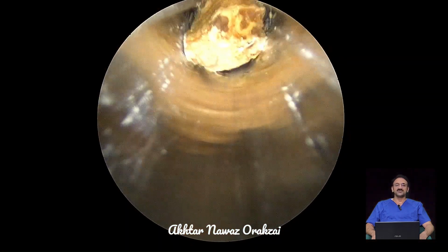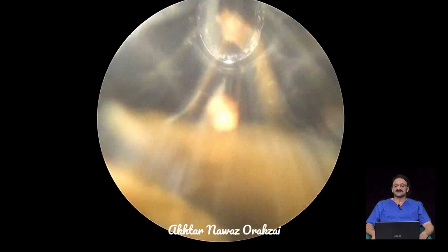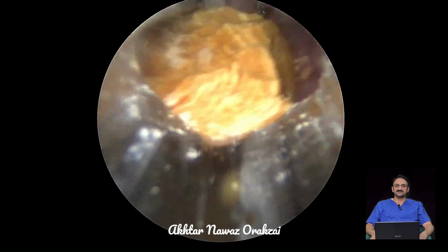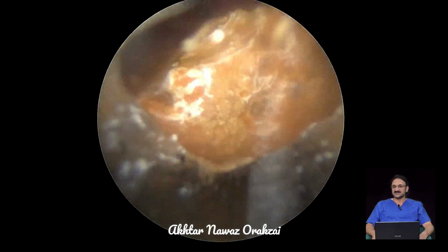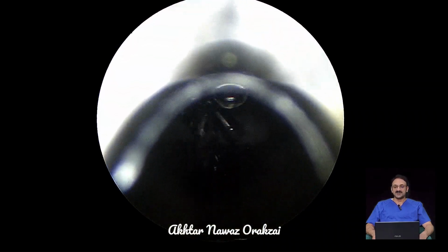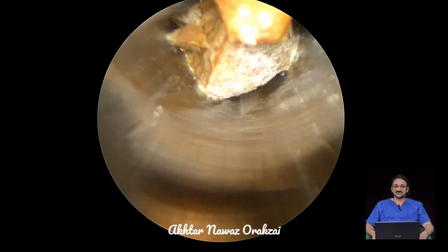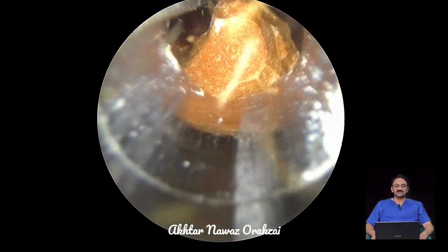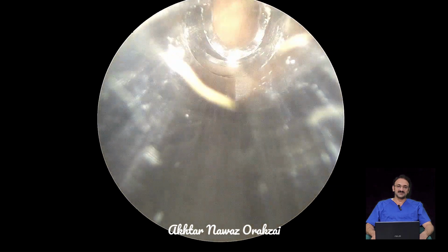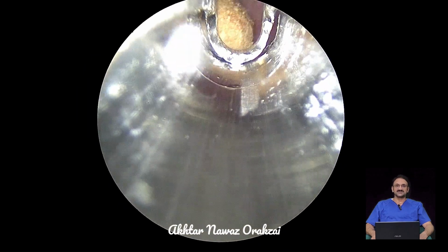The small pieces are then removed by Ellik evacuator, and after that we placed a 3-way catheter and started normal saline irrigation for 4 to 6 hours, and the patient stayed overnight with us, and the next day when the catheter was clear, the irrigation was stopped and the patient was sent home. He was also started on alpha blocker with the combination therapy of tamsulosin and dutasteride, and the catheter was removed on the 3rd day, and we will be following him up after 4 weeks with a Qmax uroflowmetry and a post void. Thank you very much. Enjoy the procedure.